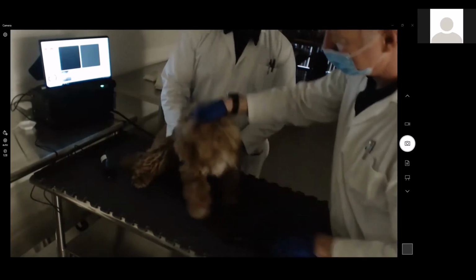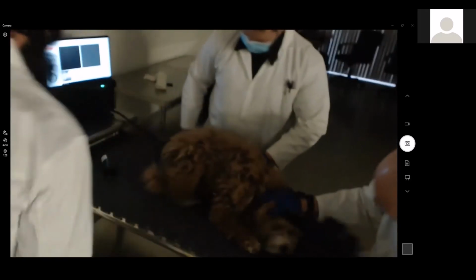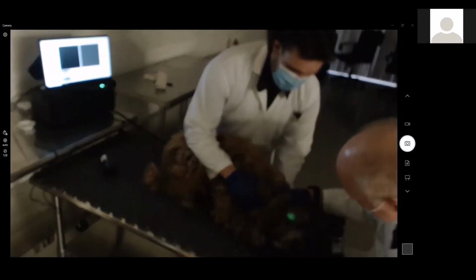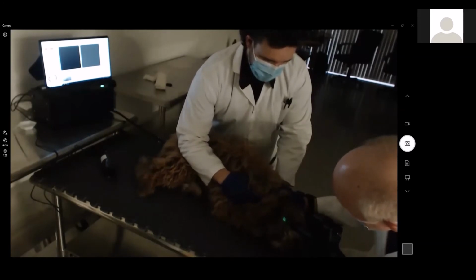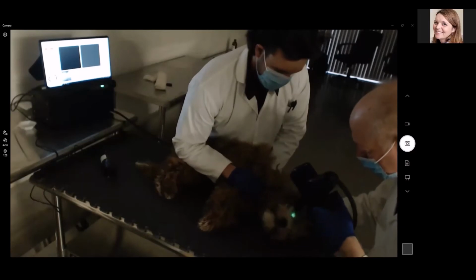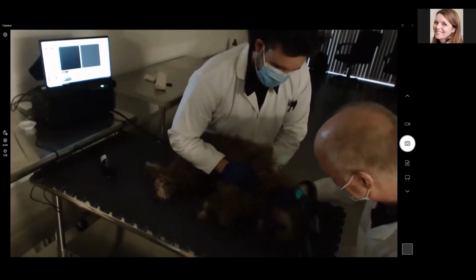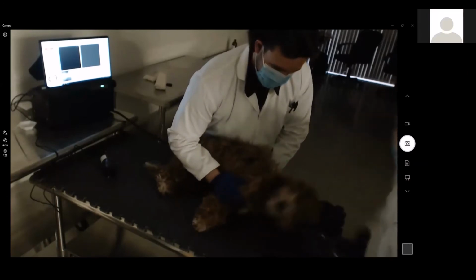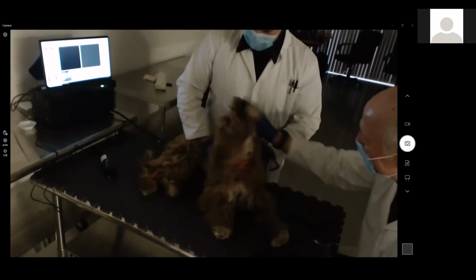Good boy. Work with me here. Good boy. Let's see if we can get you laid down. Let's just try that. You're a little different, okay? A little different. It's okay. He is just all over the place here. Oh, that's adorable. It's adorable, but not getting much done.